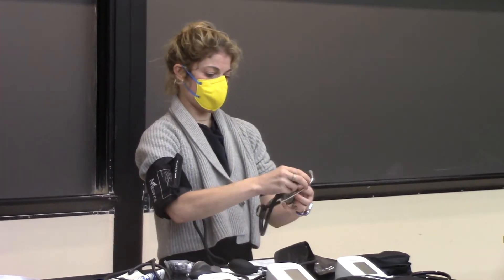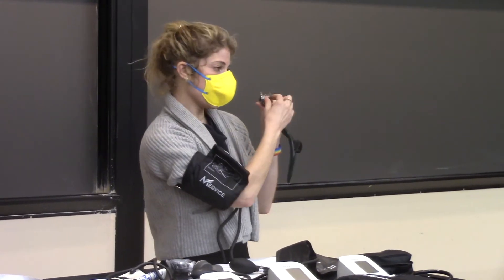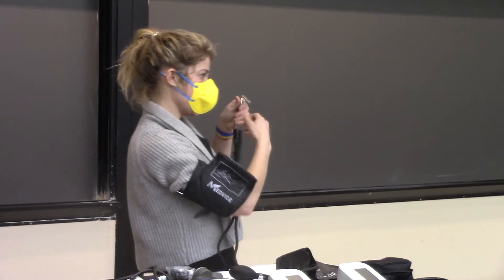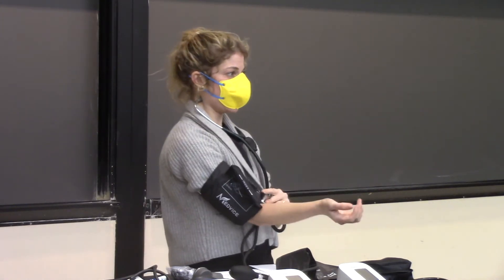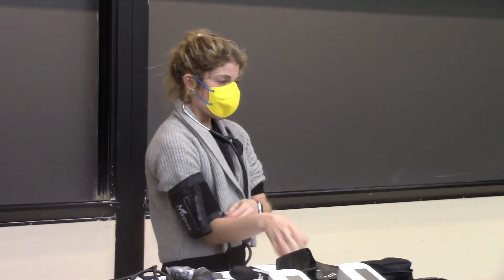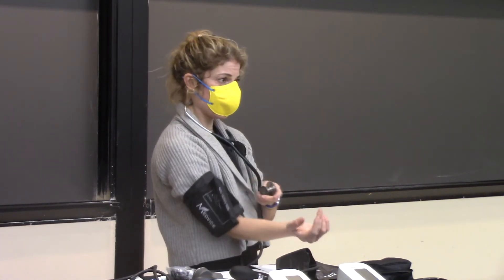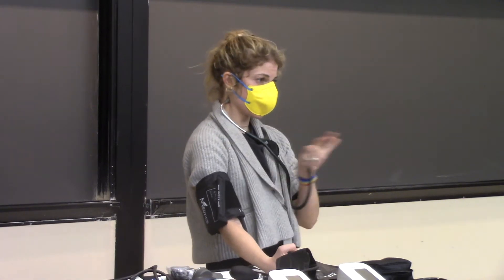Then you're going to put your stethoscope on. This is the bell of the stethoscope — you don't really need to know about that. This is the diaphragm, and we're going to use the diaphragm. Place the diaphragm right on where you found the brachial artery. The person's arm should be nice and relaxed, at about a right angle, at the level of the person's heart. Both feet of the person should be on the floor — no cross-legged seated positions.